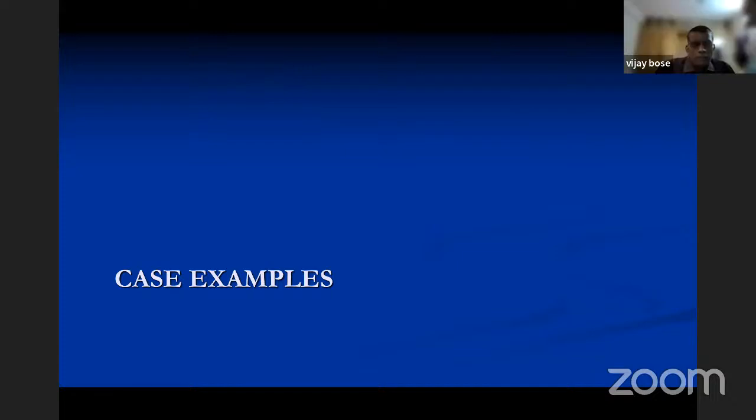I think the version can be changed significantly, and we do it in all cases. But the important thing is you have to start off like that, based on a starting point where you broach it, where you start anterior, posteriorly. So we do it in all cases. We try to either give more antiversion or less antiversion on every single case.